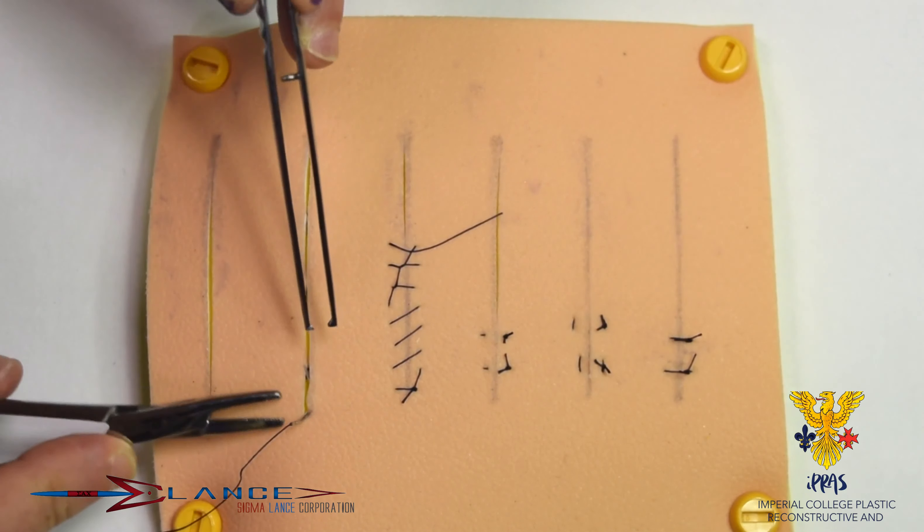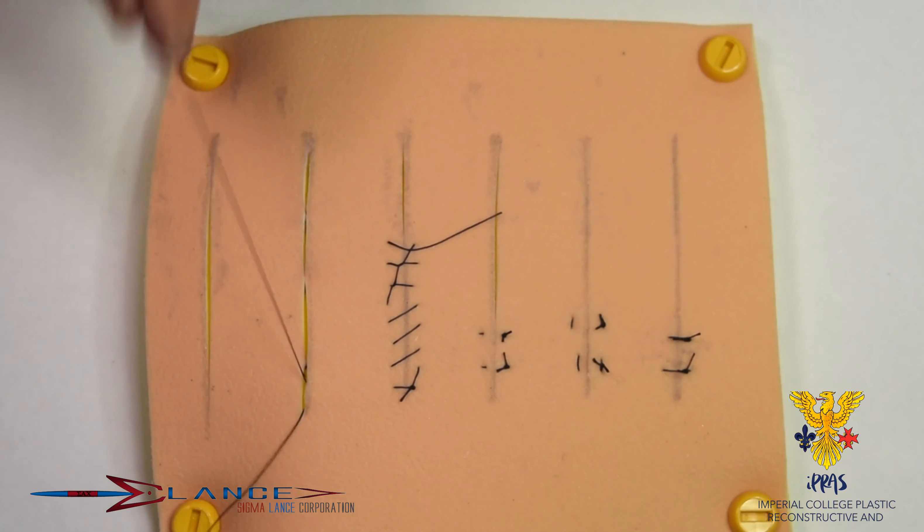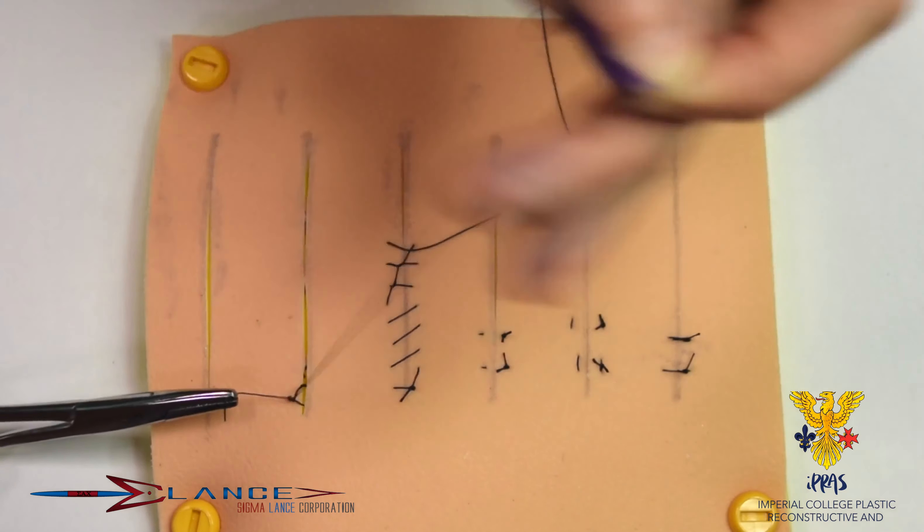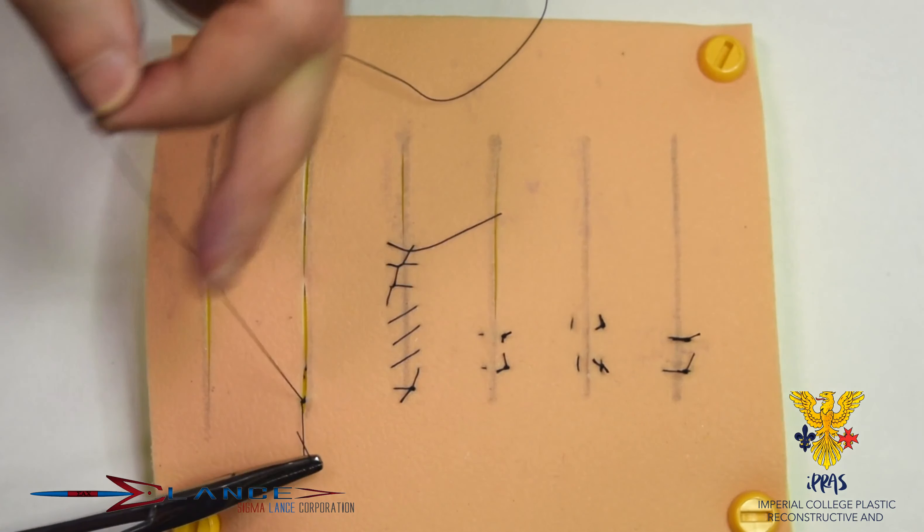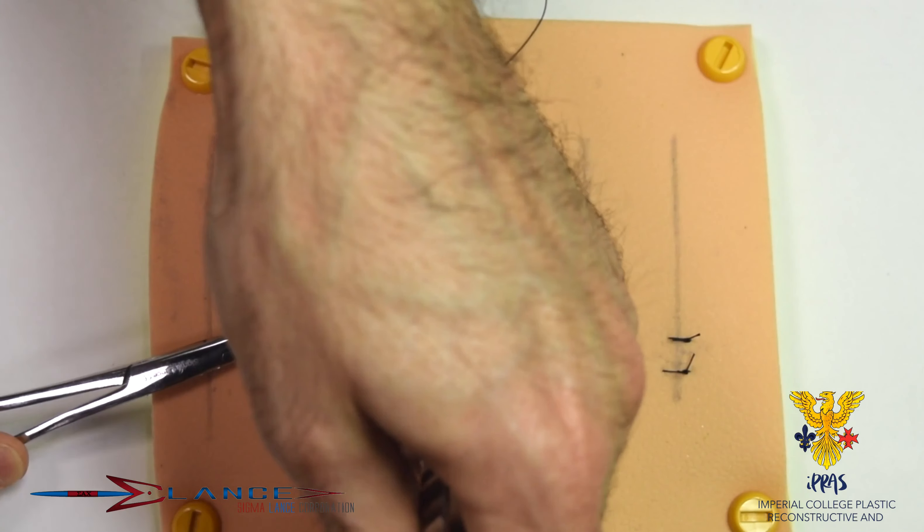The securing stitch is usually on the far side away from you. It doesn't have to be a big bite, but it has to be in that dermis. The dermis is a little bit thinner here than it would be in normal life, more like an 80-year-old's dermis, which is always a challenge to close rather than a young person. But if you can get the stitch in there, you're doing fine.